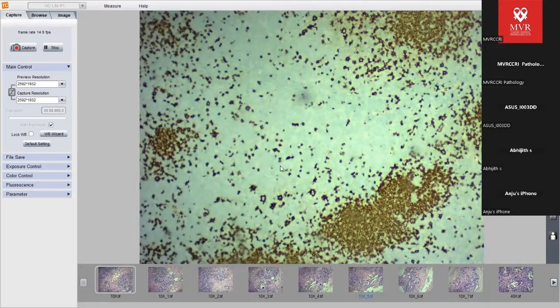Here, the size of this small cell and this cell, you can actually see the nucleus inside, the blue area inside. This is quite small. This is quite big. And this staining is in fact brighter than that of the background cells. Quite bright CD20.